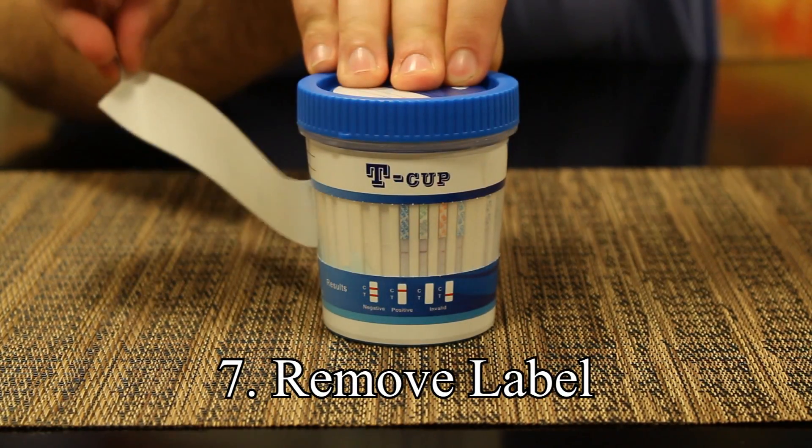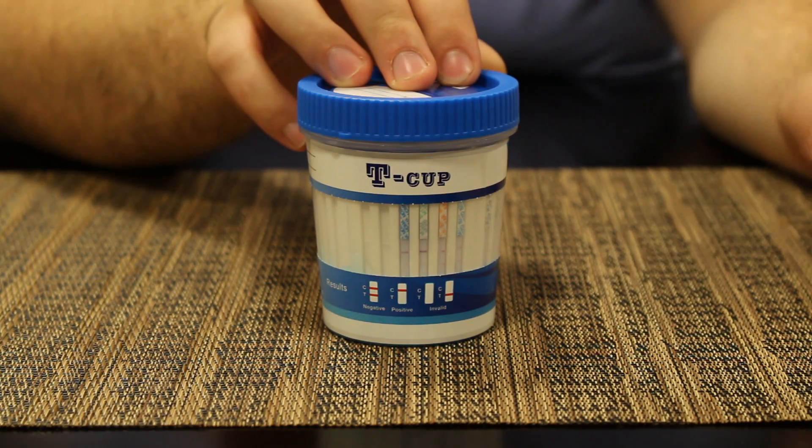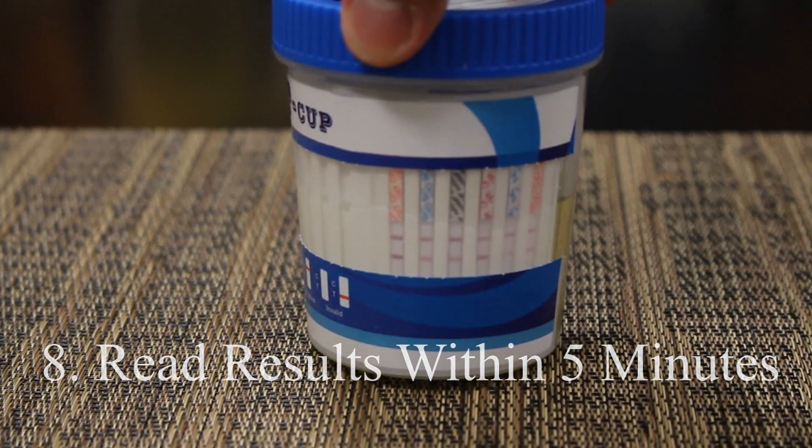Step seven: remove the label. Step eight: read the results within five minutes.